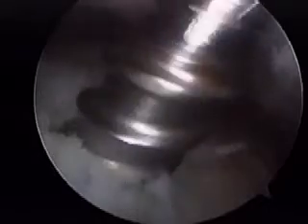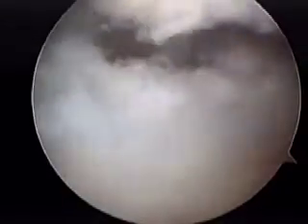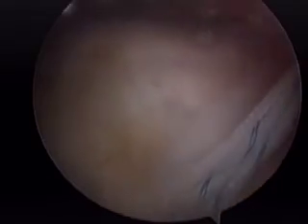So now we are seeing the greater tuberosity. We are preparing a very small bony bed just to put one anchor. Now we are making the hole. We are using the anchor guide, and now we are introducing a 5.0 absorbable double-loaded anchor. And once the anchor was in place, using the anterior portal and a simple bird beak, we passed the first suture, the white one, in a retrograde fashion through the anterior part of the posterior superior cuff. This is what we are doing now.